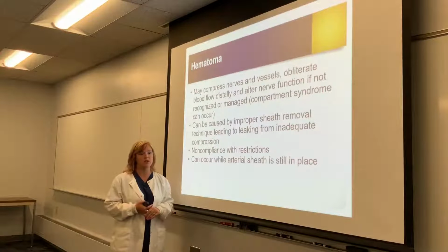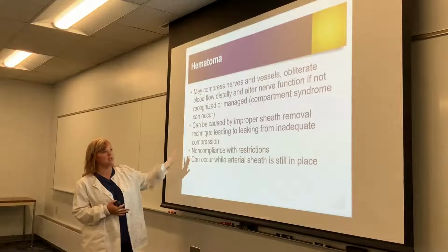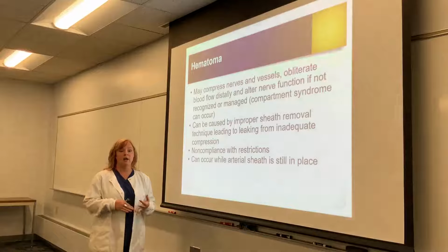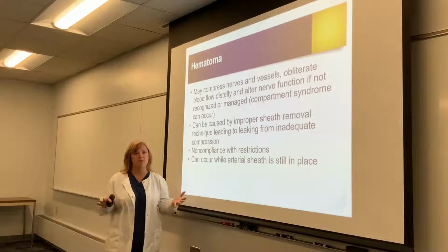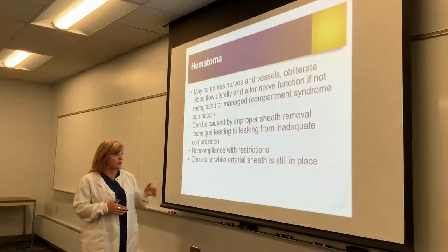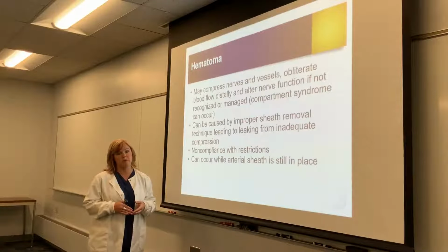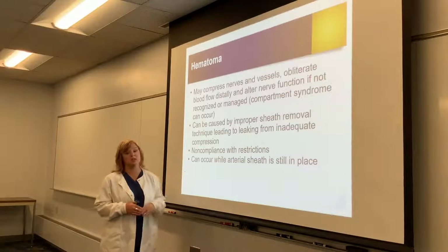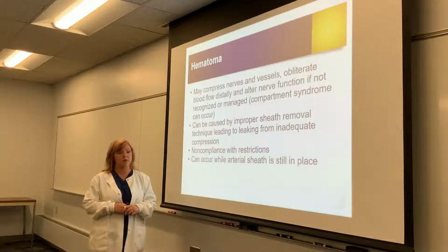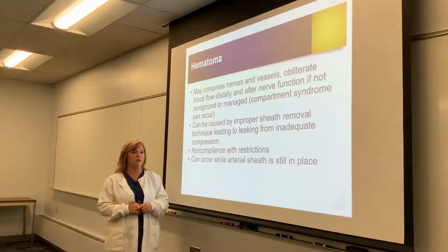So we want to make sure that, when we're taking out the sheaths, they should only be removed by people who are trained to do that. They should be doing it in proper positioning and following the restrictions afterwards. We can also see hematomas developing with patients who don't follow their restrictions. So being on 4 hours of bed rest with only being able to lift your head up for 30 degrees after the first hour can be difficult for patients.